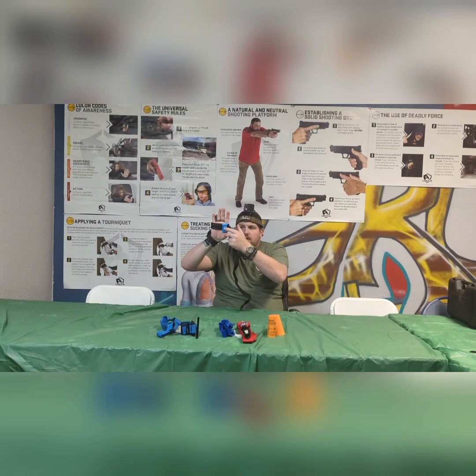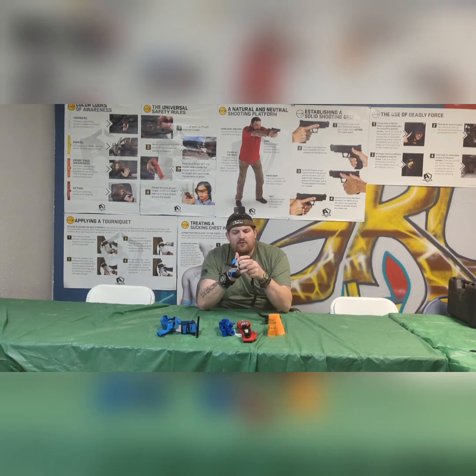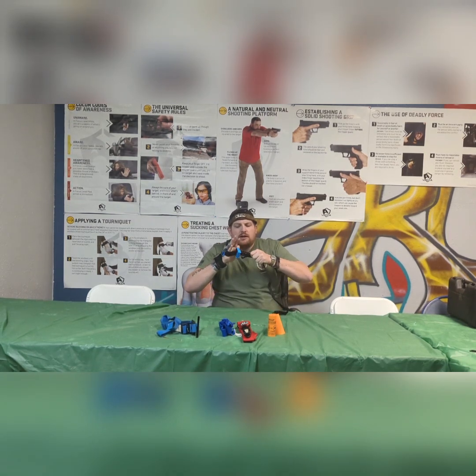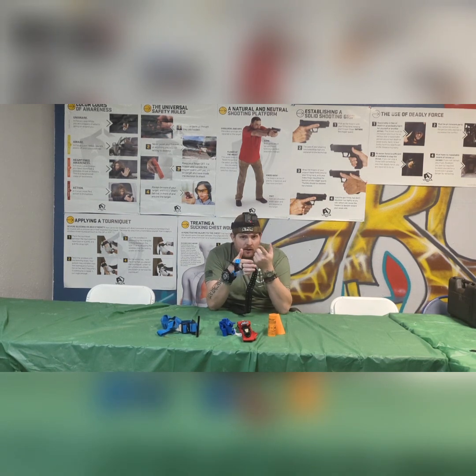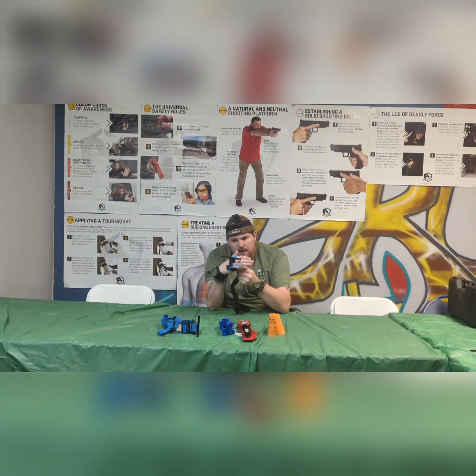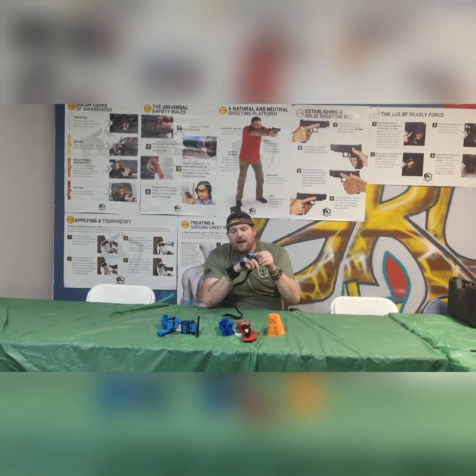This device right here has a locking mechanism, and it has two little nubs that pop up and lock into those holes. So when you get it tight enough, it makes a click and locks two little nubs in here. From this point of view you won't be able to see it, but from this point of view you can actually see the nubs there. Then you just pop it, and it retracts them down and in like that, and it releases. You still have the windlass, just like the CAT and the SOFT-T.